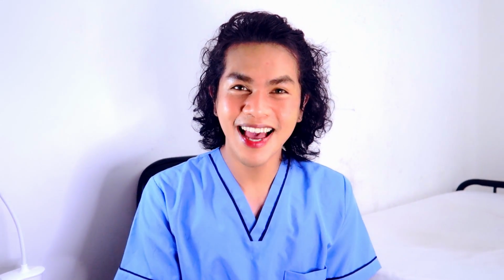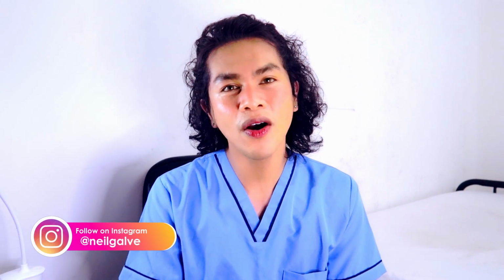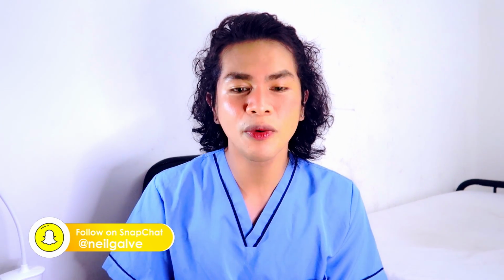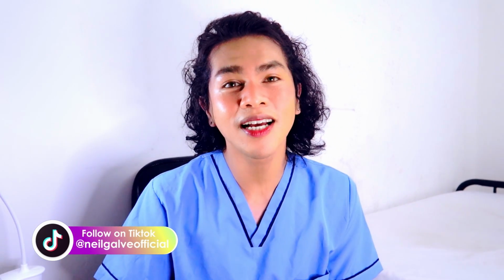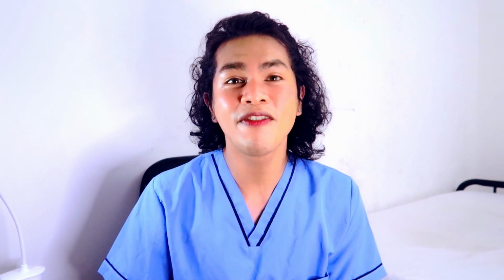Hello everybody! Welcome back nga sa aking channel. For today, isang panibagong nursing procedure ang alay ko sa inyo because on this video, I'm gonna give you a thorough discussion parang rhythm ng ating ECG procedure. Yes, electrocardiogram nga po. On this video, I'm gonna talk about ECG intervention or ECG procedures that we commonly do in the area. Alam ko na marami pa rin kasing nalilito at maraming kailangan ng refresher kung paano nga ba gagawin yung ECG. This is actually a very helpful skill sa ating mga nurses, lalong-lalo na sa lahat ng mga nagtatrabaho dyan sa ER, sa EMS, o kahit saan pa sa ward. This is actually a very helpful skill.